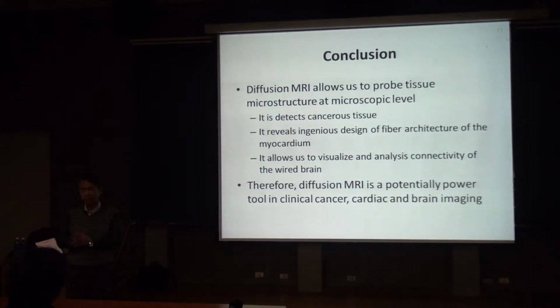And we found that for the language network, we can analyze the fiber tracts, like the arcuate fasciculus. It's a special terminology, but there are many fibers involved in the language network. And when we study those fibers, we can see the difference between left-handers and right-handers.